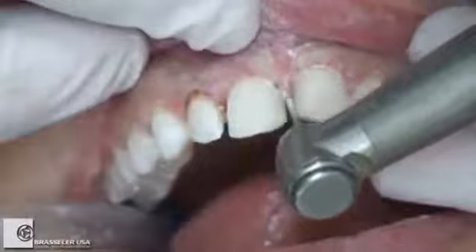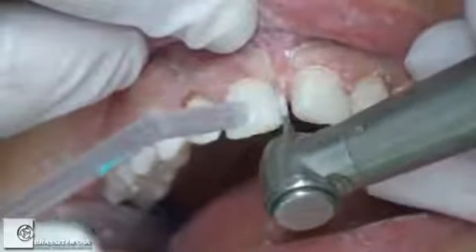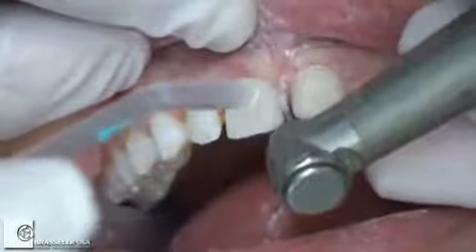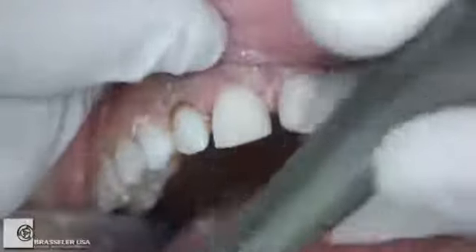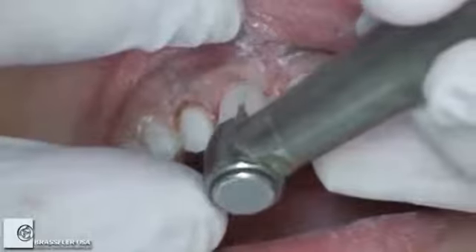Now, if you've noticed, I haven't packed any cord at this point. There's a reason for that. I want the margin of my veneer to be at or slightly supragingival if possible. Interproximal, since we're going to have to close space, we need to go slightly subgingival, and we'll do that after we pack cord.